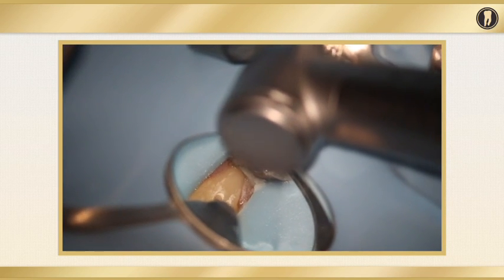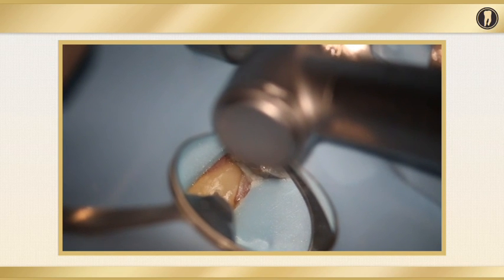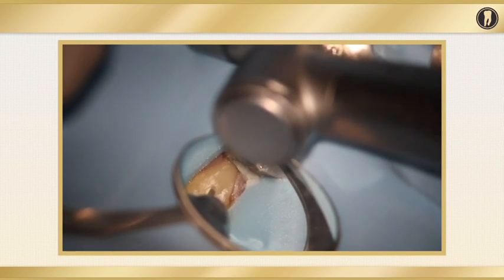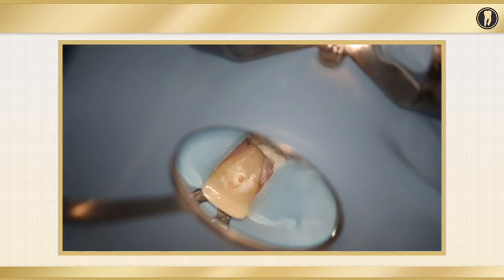I mean, 5 minutes is really an eternity of drilling into a small anterior access. But if you take your time, you can get in there and you can be successful in your root canal treatment. Now let's talk about how you access anterior teeth that have a porcelain crown, either a porcelain fused to metal crown or an all porcelain crown. Let's talk about accessing through crowns.